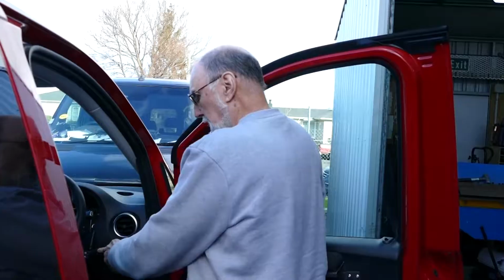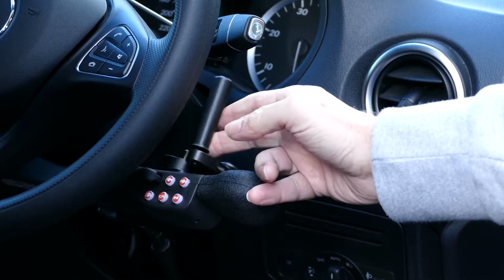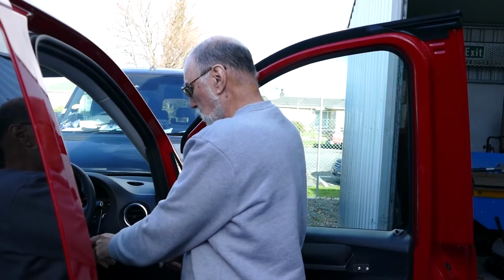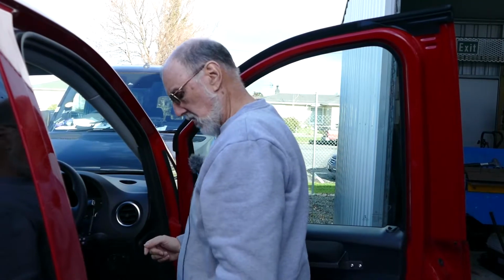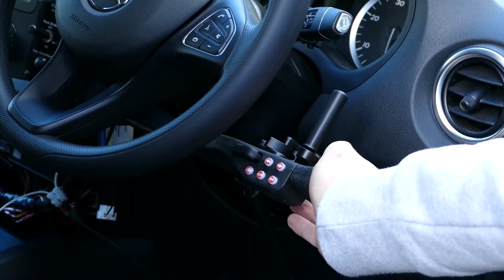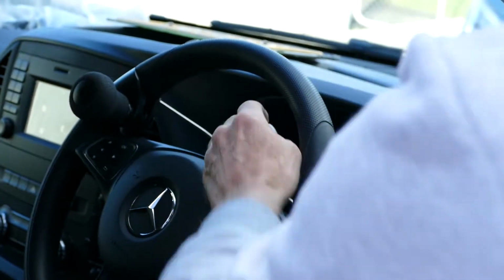You push away to brake, which is the conventional way of doing things, but the accelerator is just a little trigger here. And then there's the indicators and secondary controls are actually on the hand control. You've got a standard steering wheel knob. And the thing that's slightly different with this is that the gear selector is here on the right hand side. So they've put a crossover bar so that you can have your brake on and then flick it up and it will put it into drive.